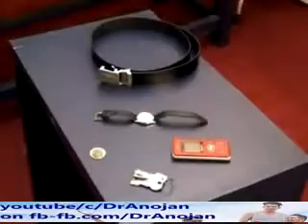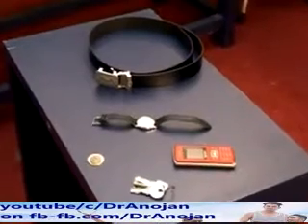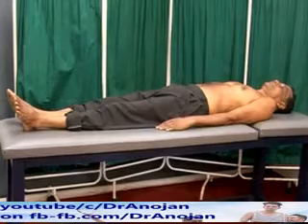Ask the patient to remove any metal objects or electronic devices that may interfere with the recording of the ECG. The patient should lie down on the bed and relax, as skeletal muscle movements will interfere with ECG recording.